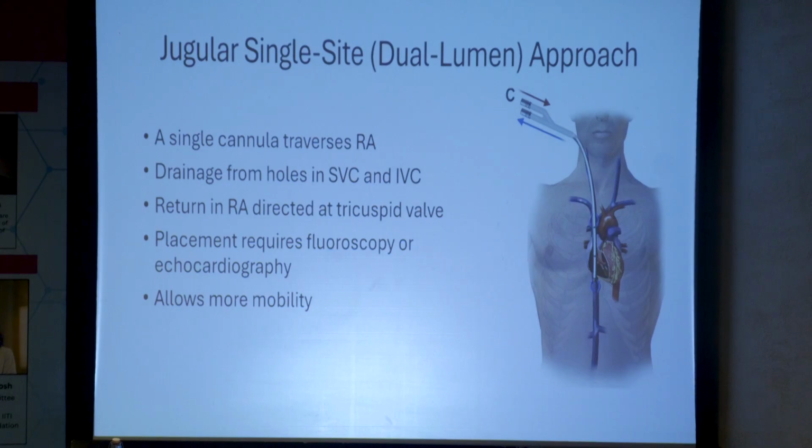It's really uncomfortable. Having real-time imaging with fluoroscopy is considered mandatory in our institution. The other alternative, depending on what your resources are, is real-time echocardiography by somebody who's really good at interpreting cannula position going through the right atrium into the IVC. At Michigan, most of the time we do this either in the operating room or in the radiology suite with fluoroscopy, and it's not permissible at the bedside without exceptions that I'm aware of.